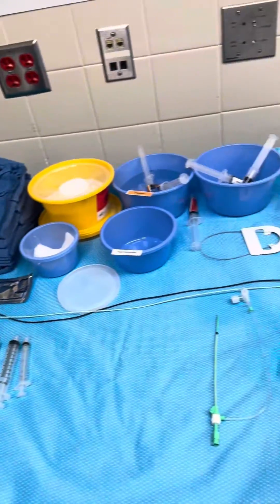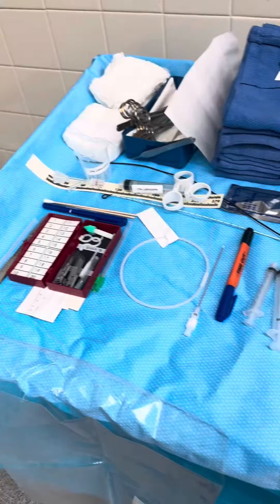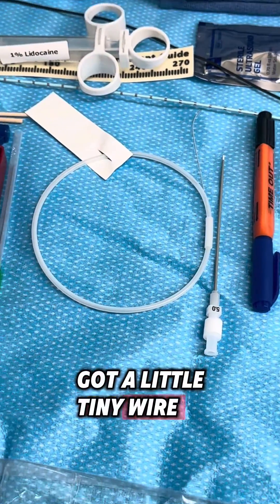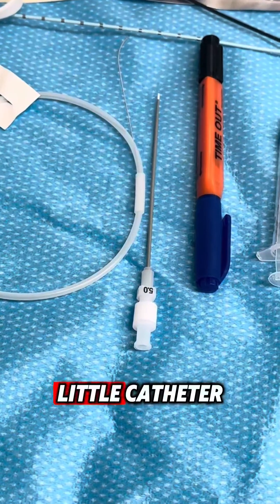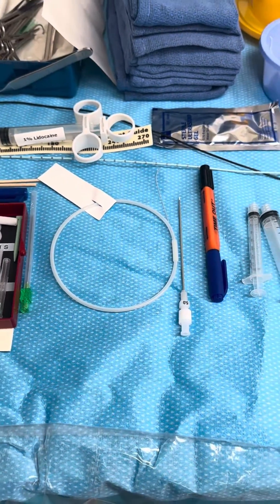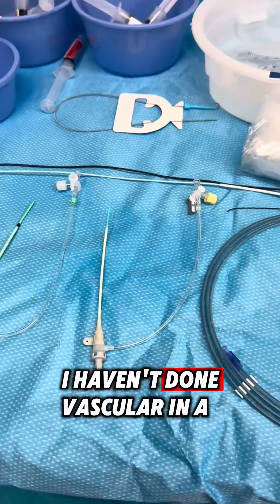So this is some of the stuff that you have on your back table when you're doing vascular. There's a little tiny wire there, a little catheter — I think that's the access catheter right there and the access wire. I forget the names of a lot of this; I haven't done vascular in a while.